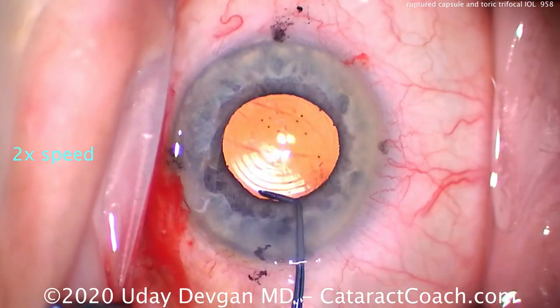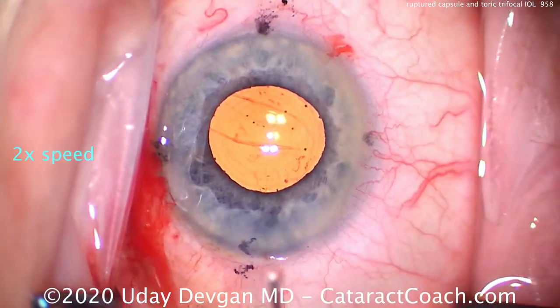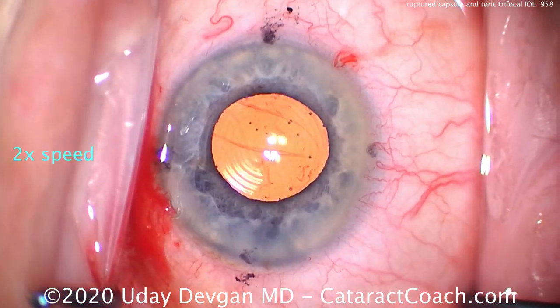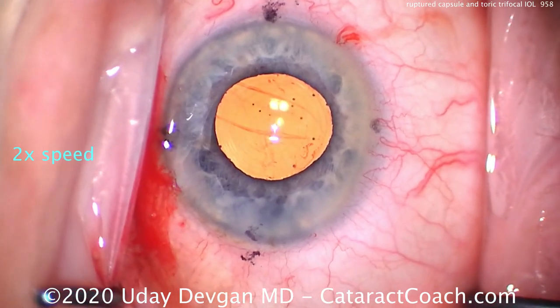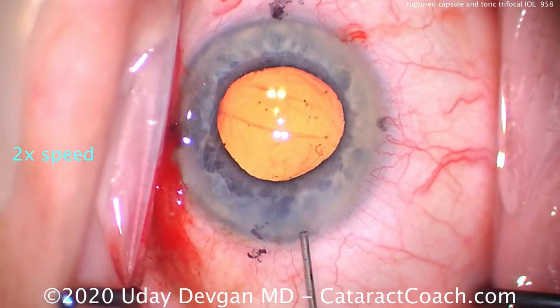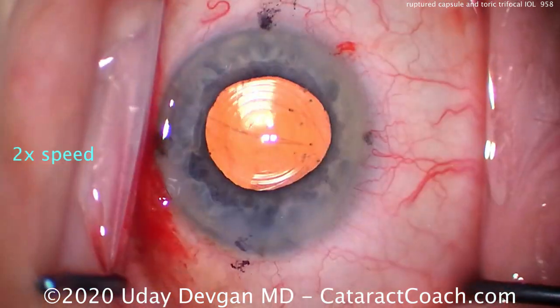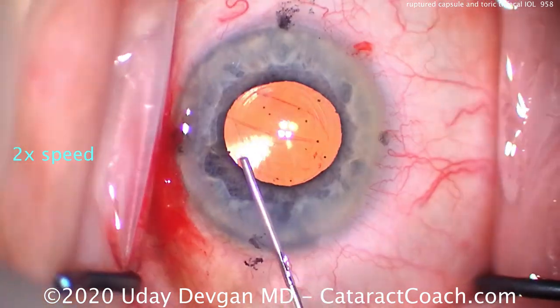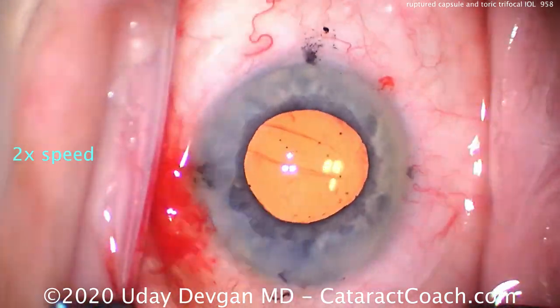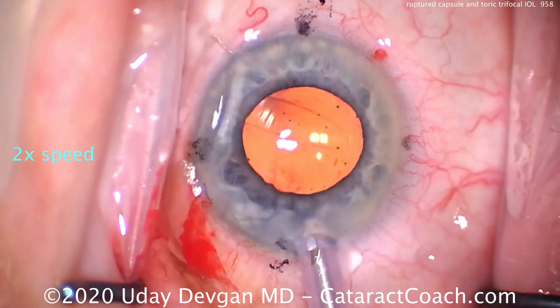There's still plenty of support — the open zone is there centrally — and now we're just confirming the orientation of the lens. We'll pre-hydrate and seal the incision even though there's still viscoelastic in the eye, because we don't want the AC to collapse. This is a smart move so that we don't ever have collapse of the anterior chamber. This eye has a small opening in the posterior capsule but all of the vitreous is in place — the anterior hyaloid face is intact.